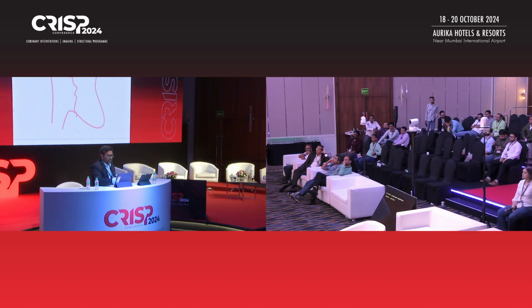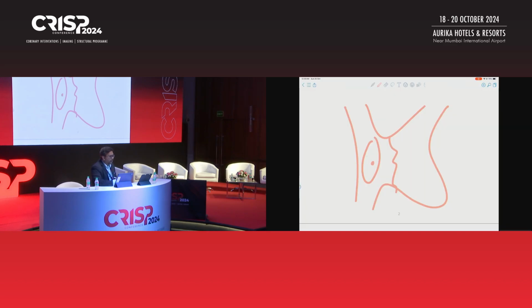If this is the heart and this is the septum, for medial leaks he will puncture in the anterior mid part, but a bit anterior. Normally he takes all the transseptal punctures here. That's his point. It is only for medial leaks that he will be there.